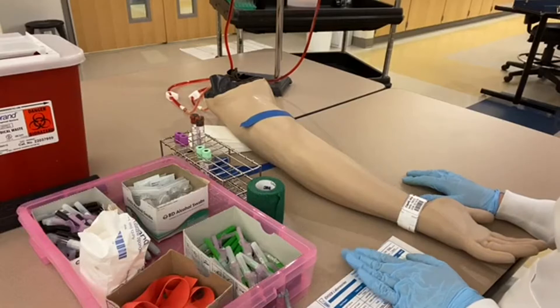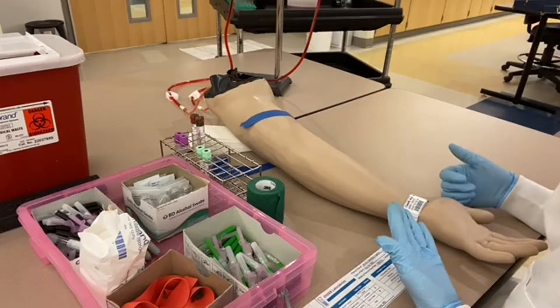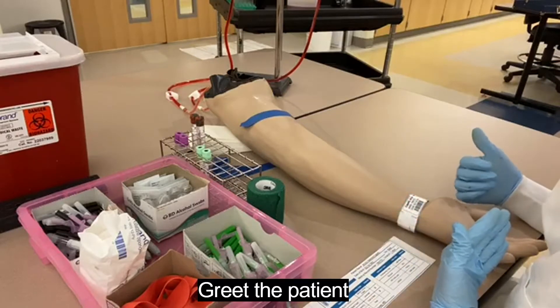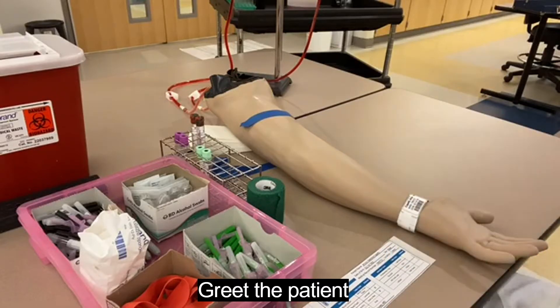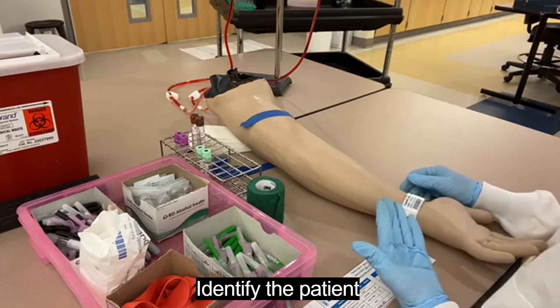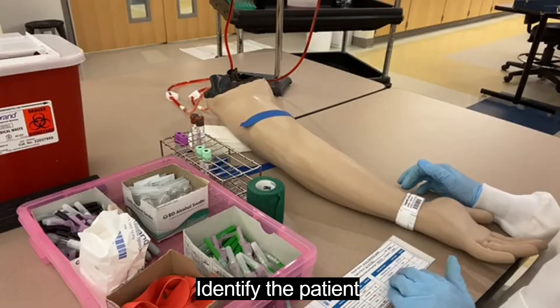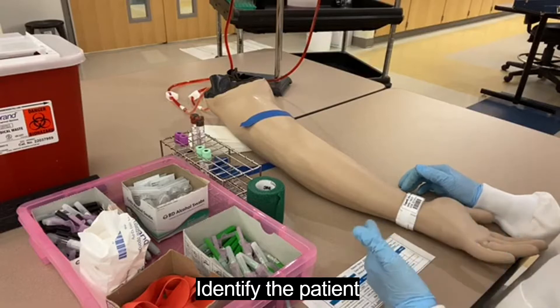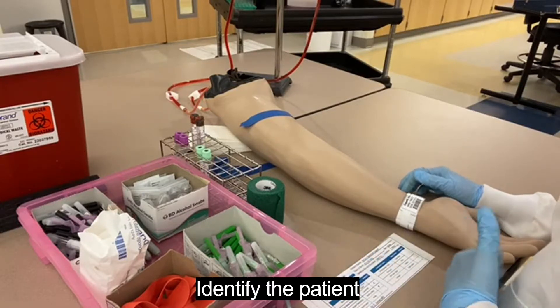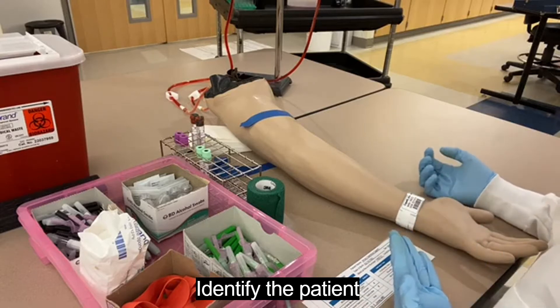In this video I'm going to show how to do a basic venipuncture. For a conscious patient, you'd come into the room and say hi, my name is Lacey, introduce yourself as their phlebotomist. Because the doctor has ordered some important tests, ask them to tell you their full name and date of birth. It's important to have them tell you their name rather than asking 'are you Arturo Capetti?' because they could reflexively say yes, which wouldn't be a true identification.